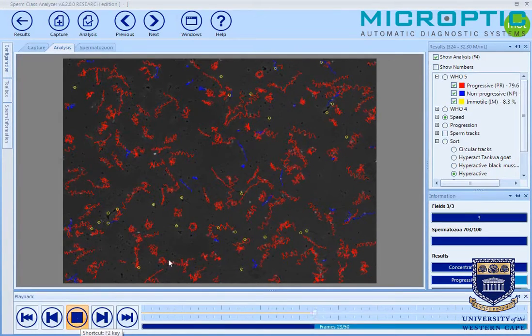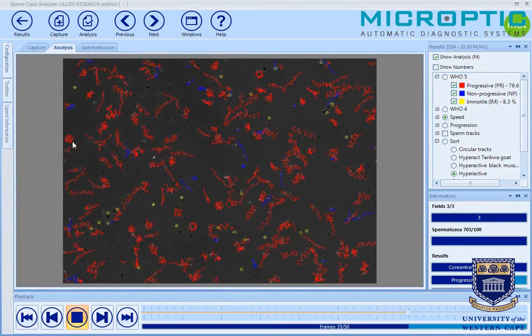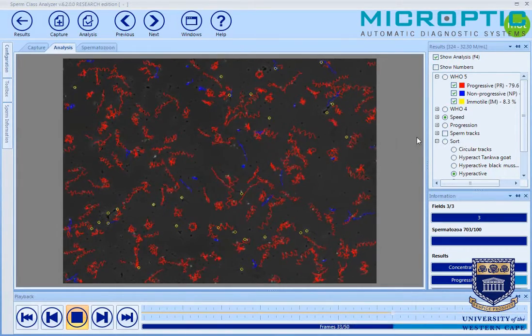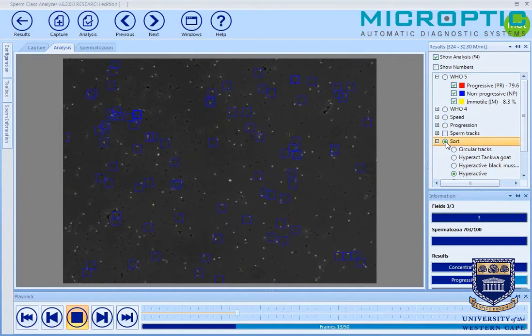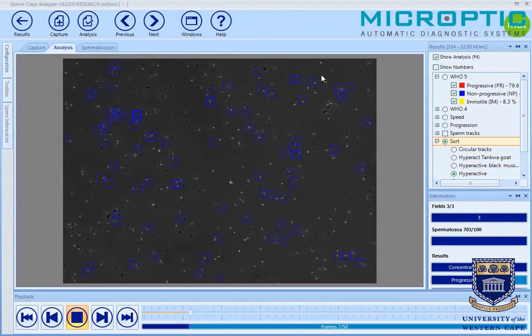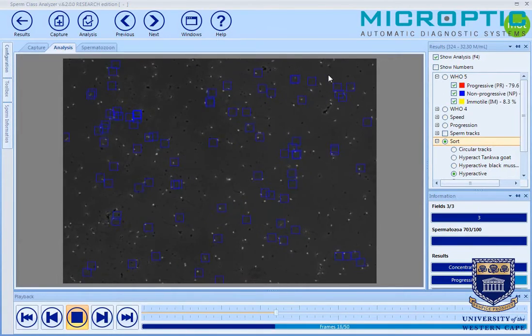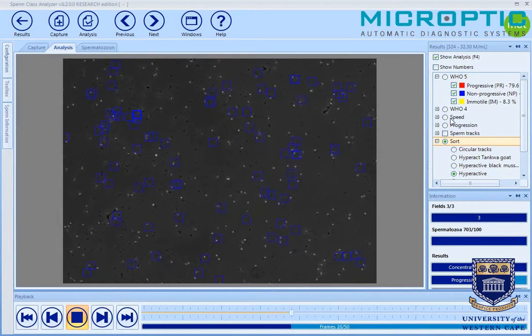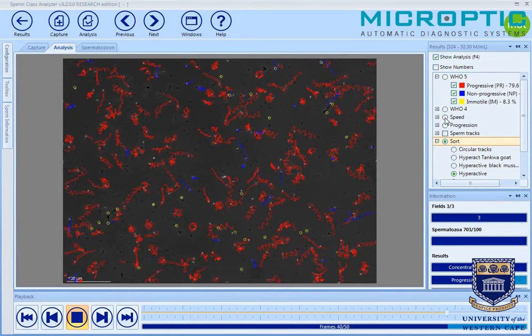Let's play the sperm — it can be seen there are areas of really vigorous sperm motility. The pattern is looking much less progressive, which is typically encountered when sperm become hyperactivated. And if we look at the sort function, you can see that those blue blocks indicate sperm swimming through them are all hyperactivated. So in this particular field, we have a very high percentage of hyperactivated sperm.